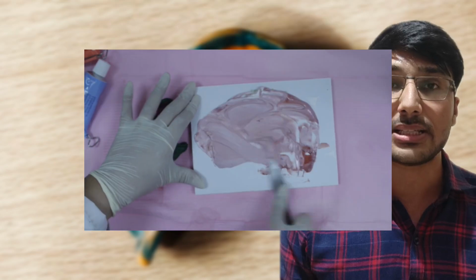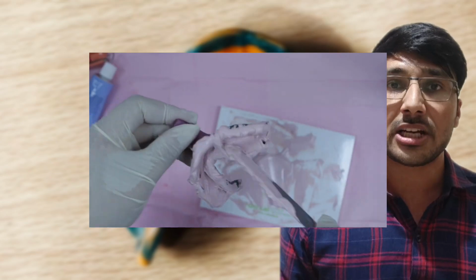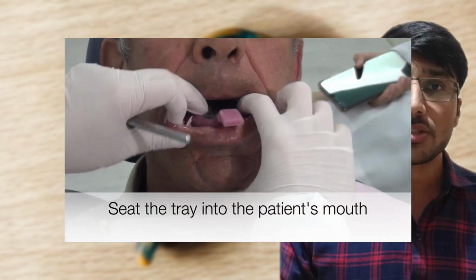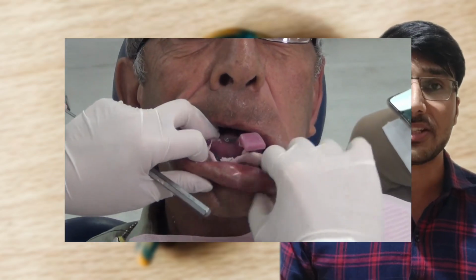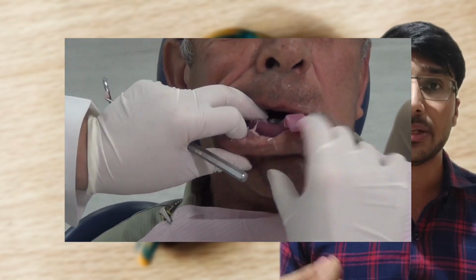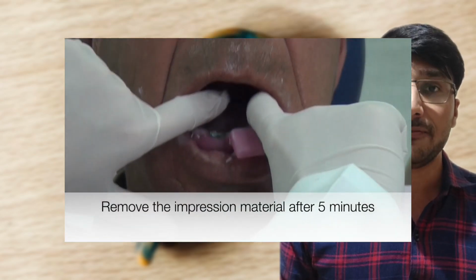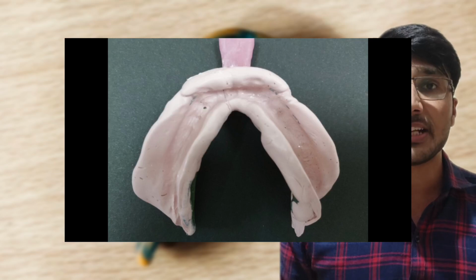Now mix the zinc oxide eugenol impression paste and load it to the tray extending to the borders. Place the tray in the patient's mouth. Don't press too much. Don't start border molding right away. Let it set to a moldable state. Start molding. Repeat the movements. Let it set. Remove the tray by breaking the suction and lifting the cheek. Observe the impression for any discrepancy. If a bubble exists, load a little material and repeat the process.